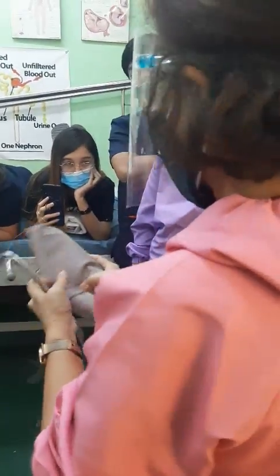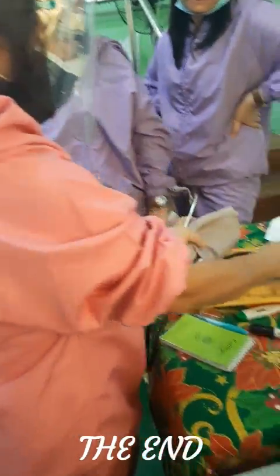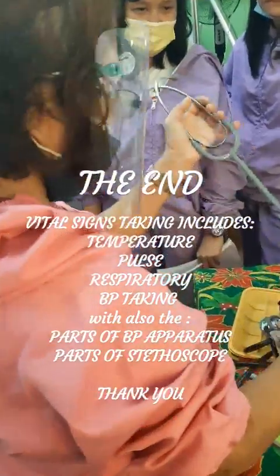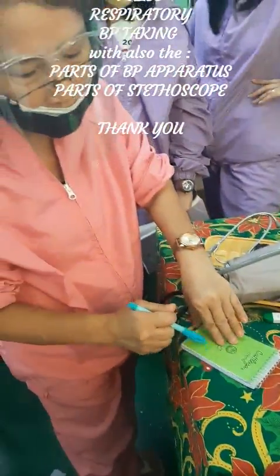After I have done the procedure, I will now do my aftercare. I will disinfect the equipment with alcohol and so on. Then I will jot down the blood pressure reading of my patient. Thank you.